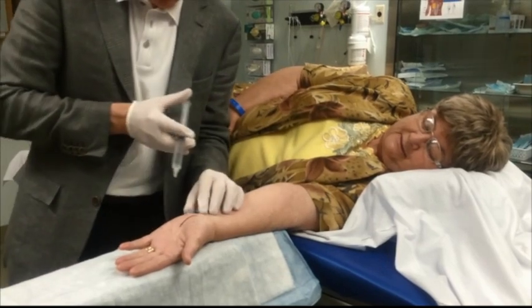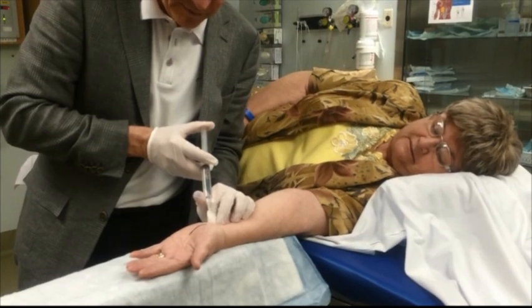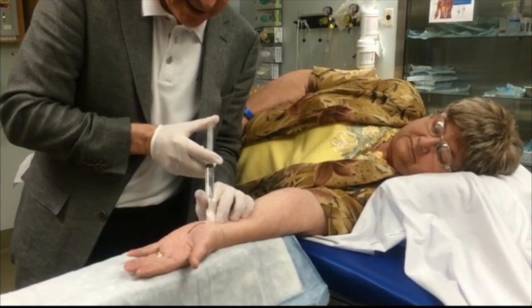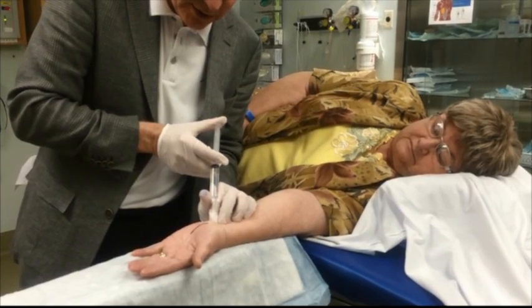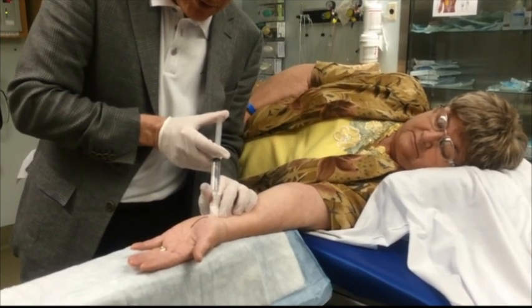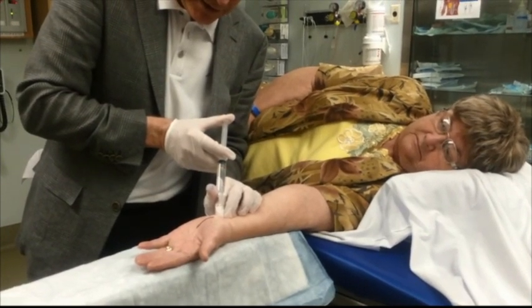If you don't move, it hurts one time. So what I did there is I pressed quite firmly with my finger just proximal to where the needle went in. As soon as I got in, I put in a bleb that I could actually see. I'm still pressing on the plunger incredibly slowly, because I need this needle site to get numb. The syringe was stabilized with both hands, my thumb ready on the plunger. Because if you wobble that needle, they feel every little wobble.